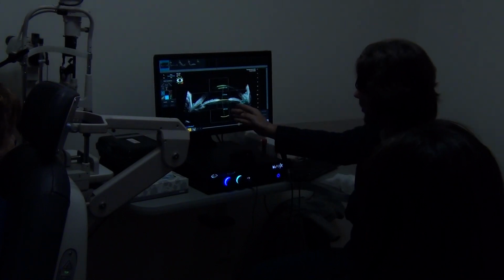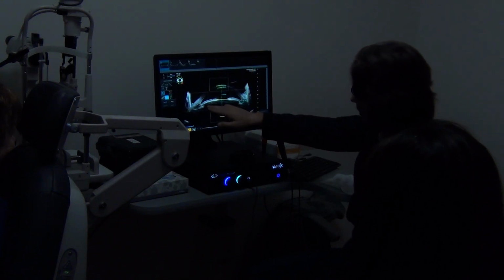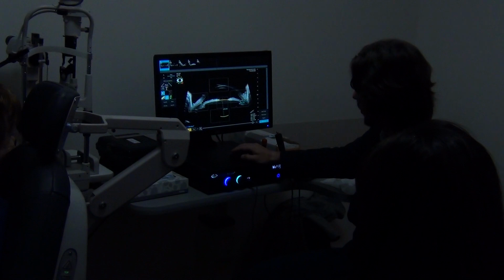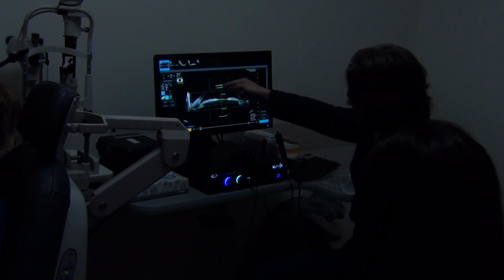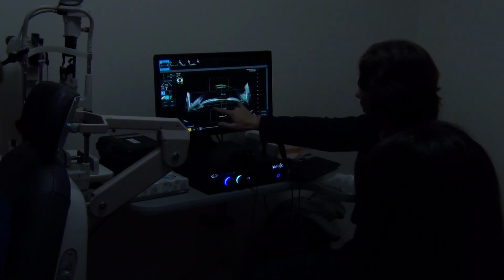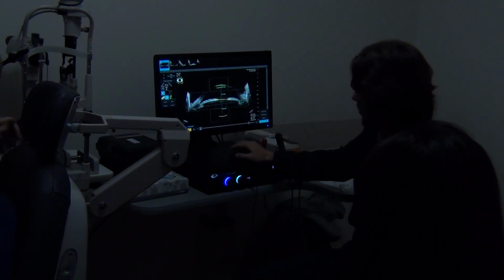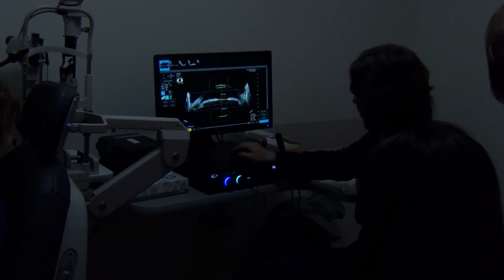And you saw those lines are appearing. So our goal is to have those blue lines as perpendicular as possible. Okay. So we can stop and we can go frame by frame. So this one is a little better, right? So it provides us the corneal thickness, the ACD, lens thickness, lens width, and the sulcus to sulcus measurement as well. So that's awesome. For sulcus to sulcus measurement, you definitely need to identify the sulcus, and you can grab each of those cross marks and bring them to the right area.